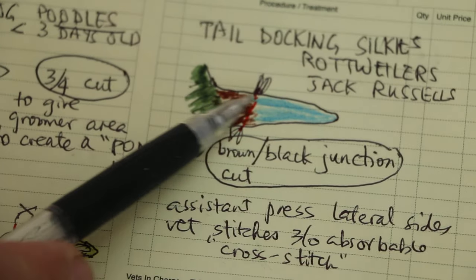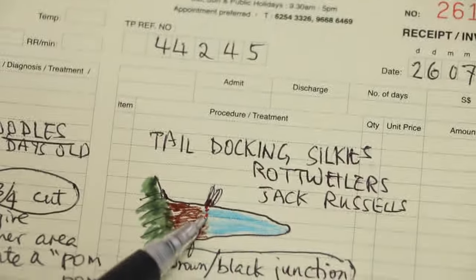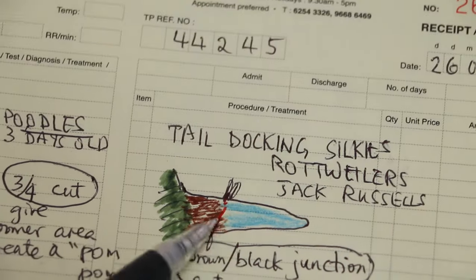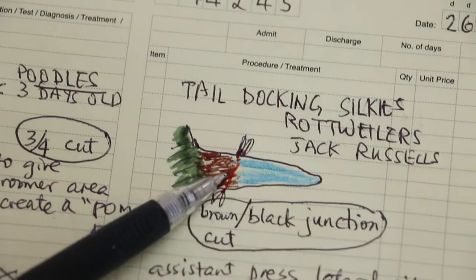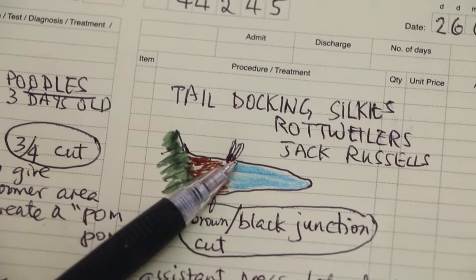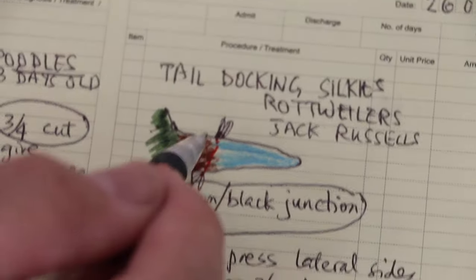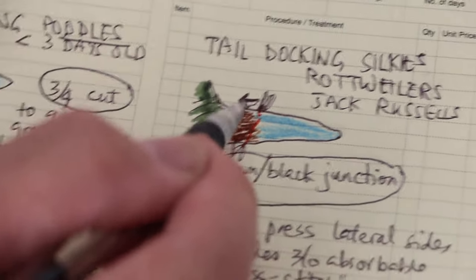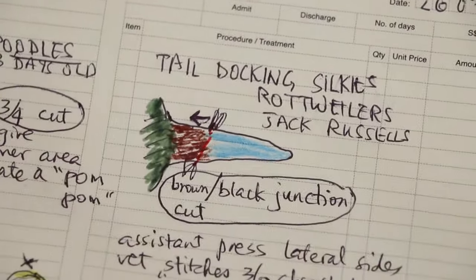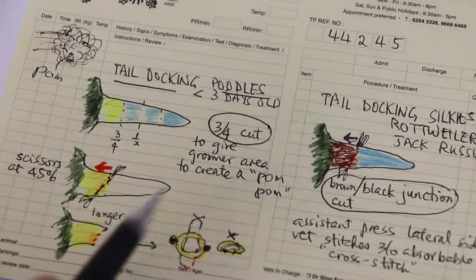Now I'm going to talk about the other type of tail docking — Jack Russells, Rottweilers, and Silkies. In Jack Russells, Rottweilers, and Silkies, there's a brown-black junction. You look at the bottom of the tail. When you cut, same thing again — you just follow this junction, the brown-black junction. Then you put your scissors here and turn, so that you have the skin with the upper part longer. Same as before. Then when you cut, you can stitch and cover the bone.